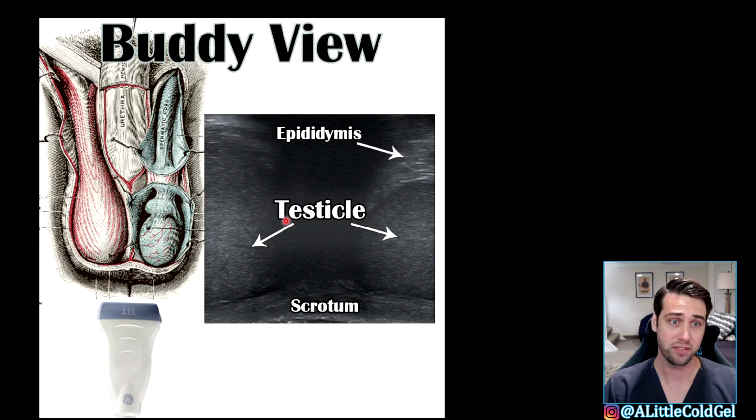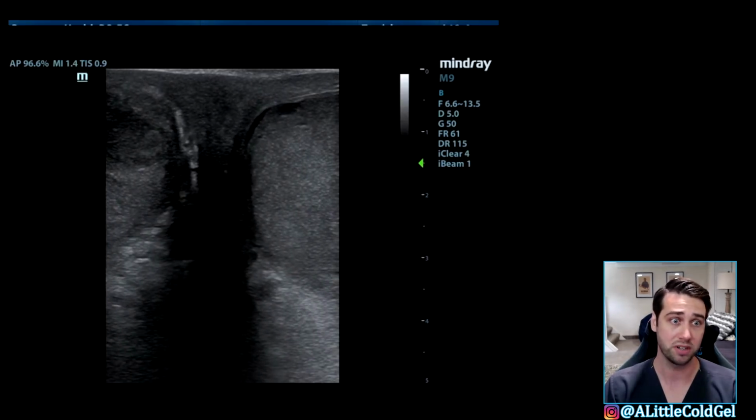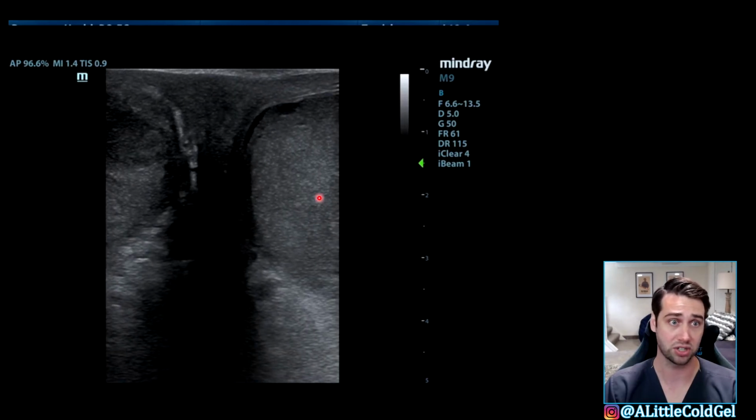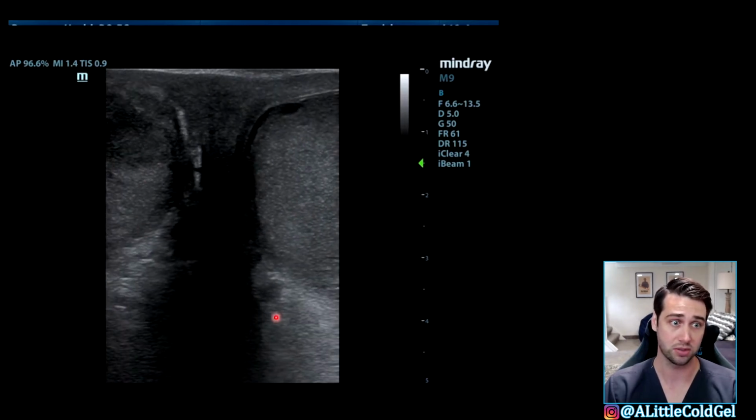So here we have the buddy view side by side with an actual ultrasound image, and this image is inverted just to match the anatomy, but you see the scrotum down here at the bottom, and then you see testicle 1 and testicle 2. On the side you can actually see the epididymis, but that's not really something you generally need to evaluate in basic testicular ultrasound. So looking at a clip of the buddy view, here we see that we have the scrotum up here now because the probe is actually touching the scrotum, and then the two testicles next to one another.